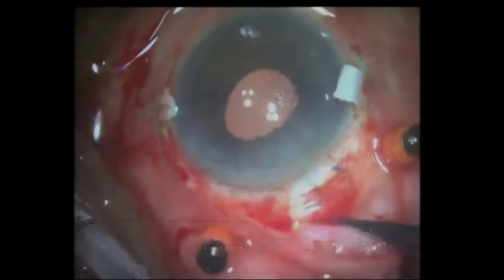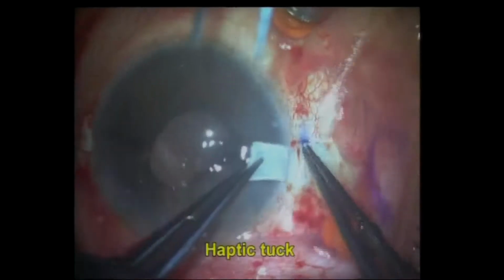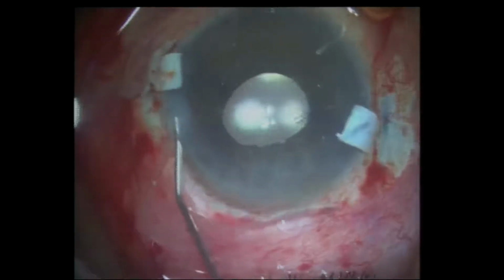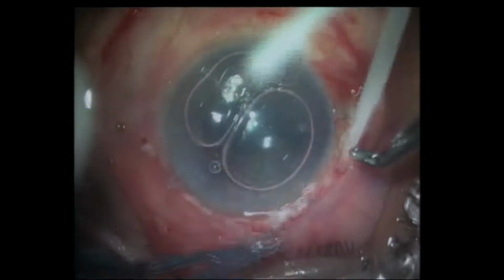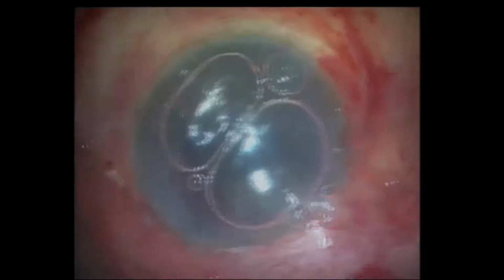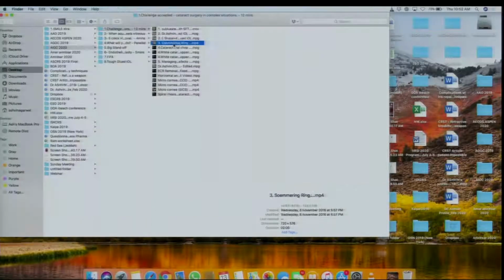and close this wound with sutures if need be. If you don't want to, that's also fine. I use them as stay sutures because some of these patients post-operatively are older and they play with their young ones and they sometimes get hit, and I've seen that before. So I try to have stay sutures in place just for avoiding trivial trauma causing any injuries. That's one of the ways of solving these problems.